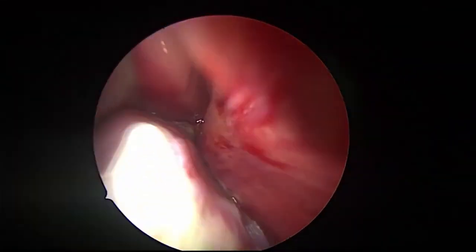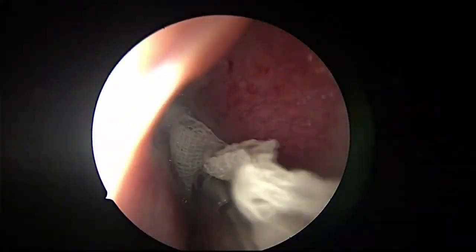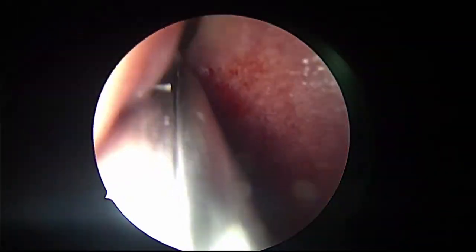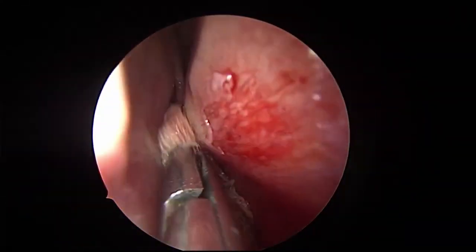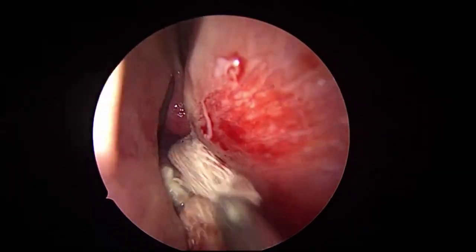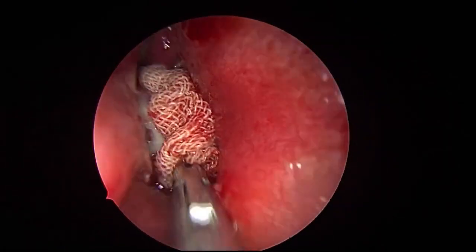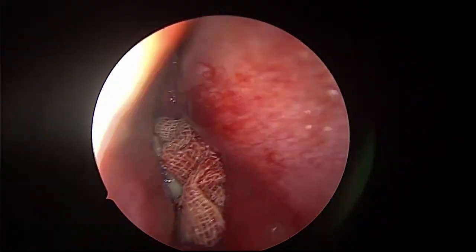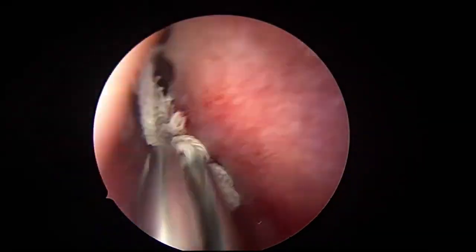See this? Nothing. What will I do? Pack again and again. See, I am not using Surgicel here. This is not like sinus surgery. Here, the major bleeding is arterial, and you have to do other maneuvers. I'm using these adrenaline soaked ribbon gauzes. We are using hypotensive anesthesia as well. Unlike FESS, this is a different pathology.